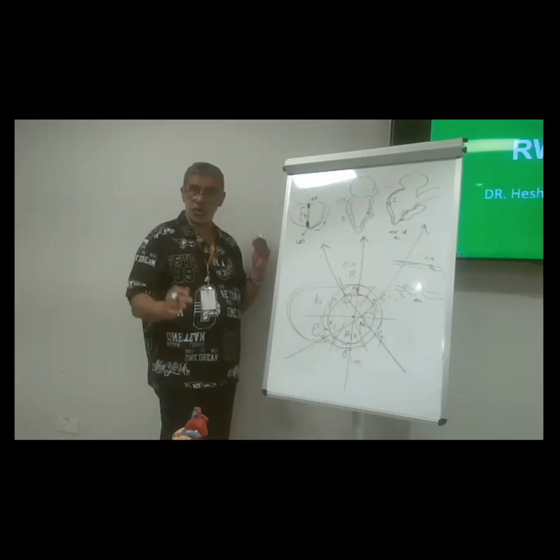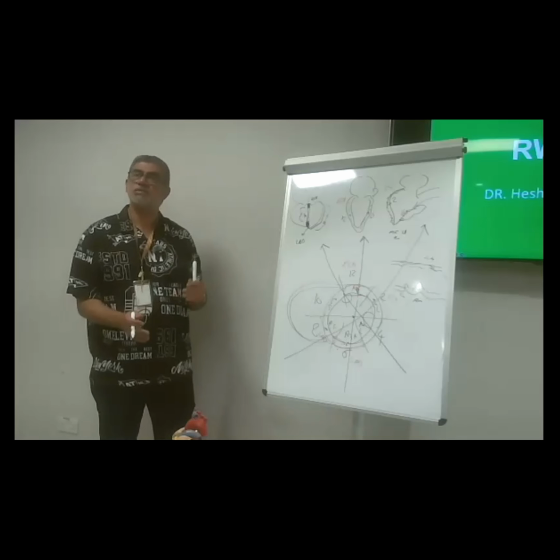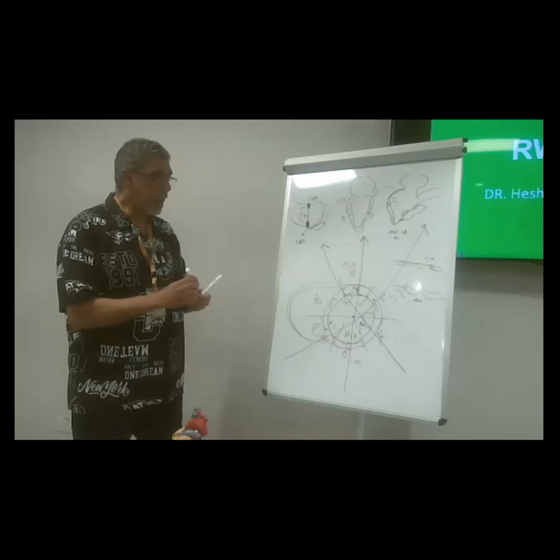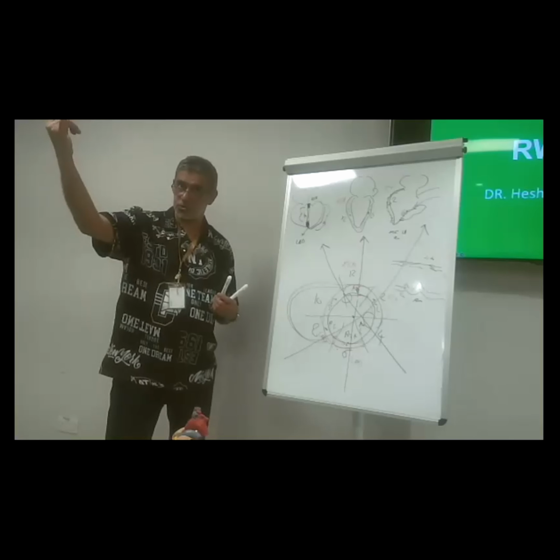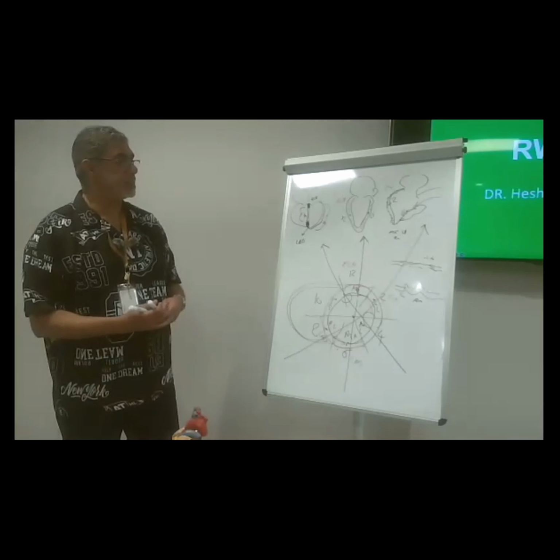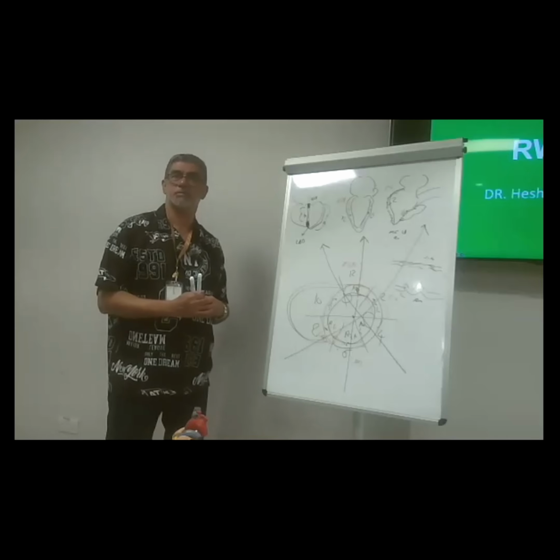To differentiate, M mode again will give you the story. Is it moving or not? Okay. So we have the wall finished. We have the motion finished. We have the thickness also finished.